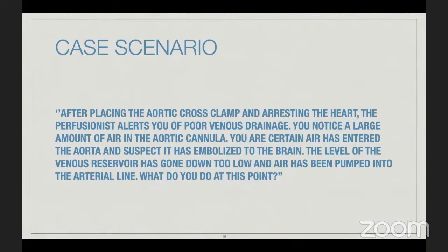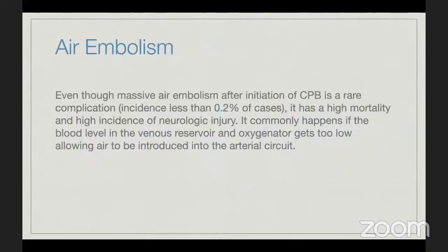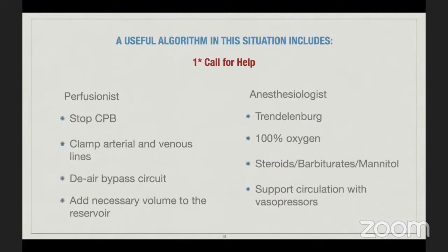Okay, thank you. So massive air embolism after initiation of bypass is a rare complication. It has a high mortality and high incidence of neurological injury. It commonly happens if the blood level in the venous reservoir and oxygenator gets too low, allowing air to be introduced to the arterial circuit.